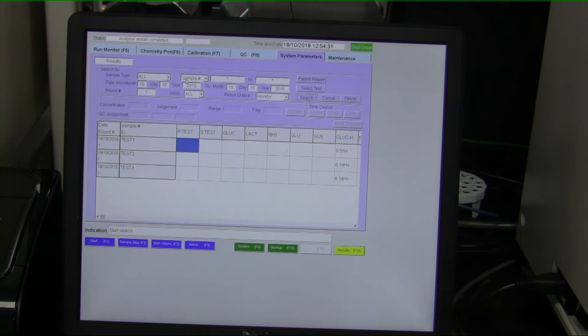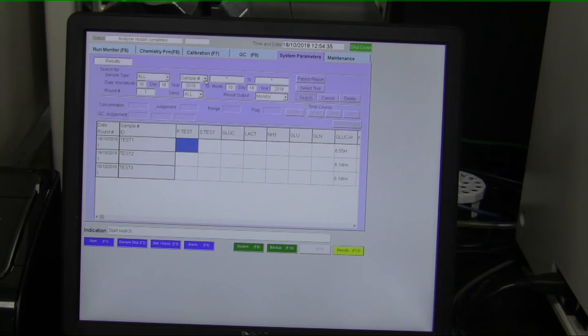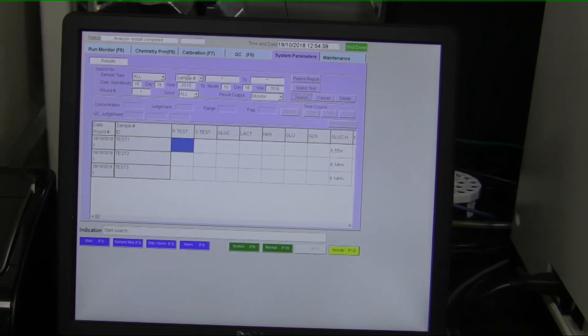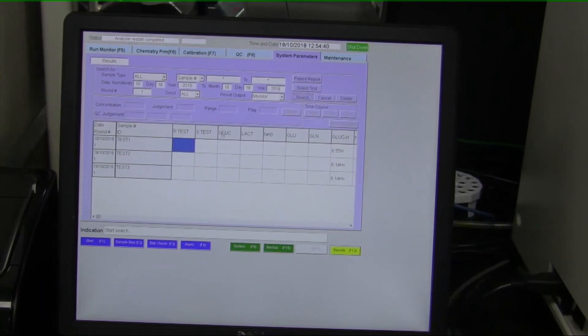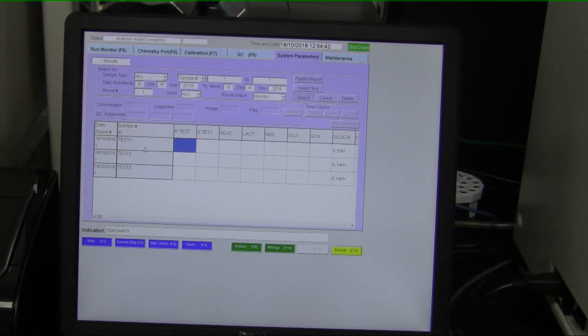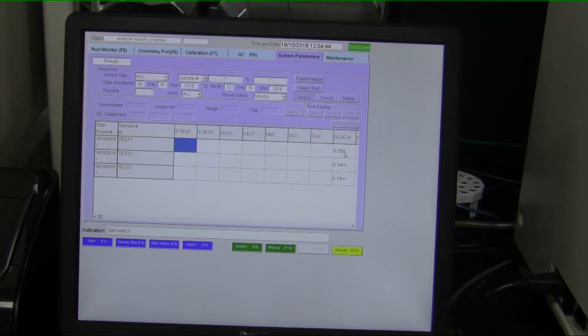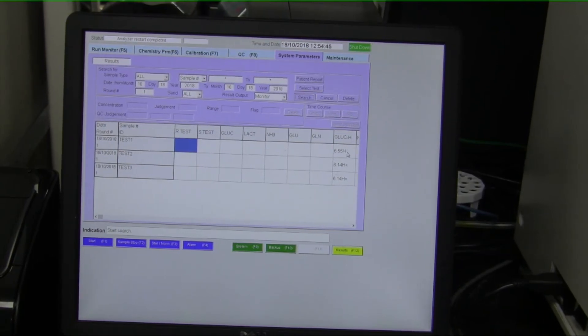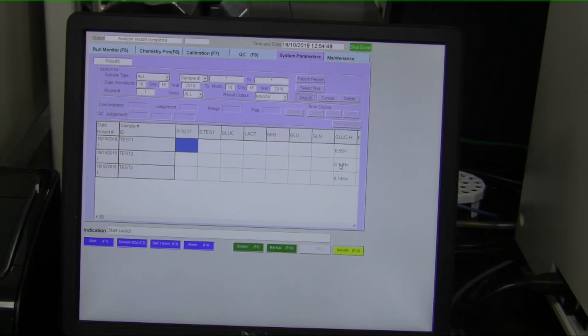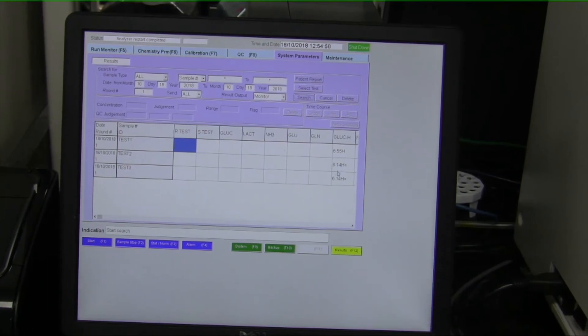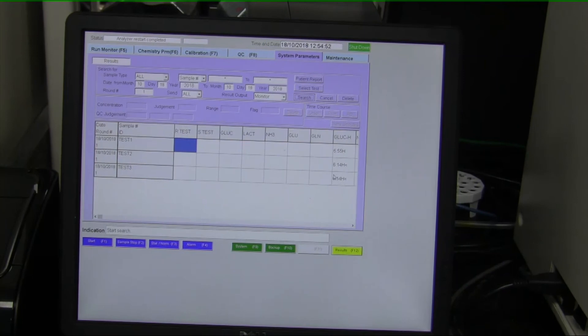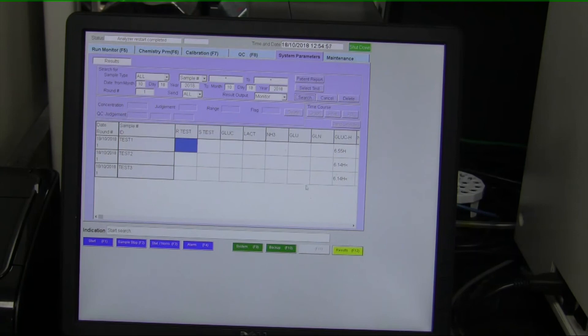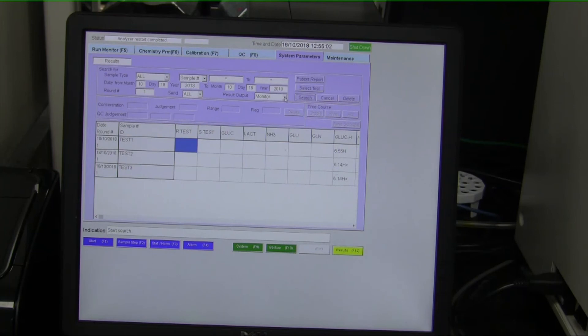But if you wanted to, you could do some more advanced search, such as dates. You could do searching by name of the sample, various advanced search parameters. So we ran three tests. On test one, the glucose result was 6.55. On test two, the glucose result was 6.14. And on test three, it was 6.14. So if we had run glutamine or glutamate or ammonia or lactate, those would be shown in these columns here. So we just did a data search and we displayed the data on the screen here.